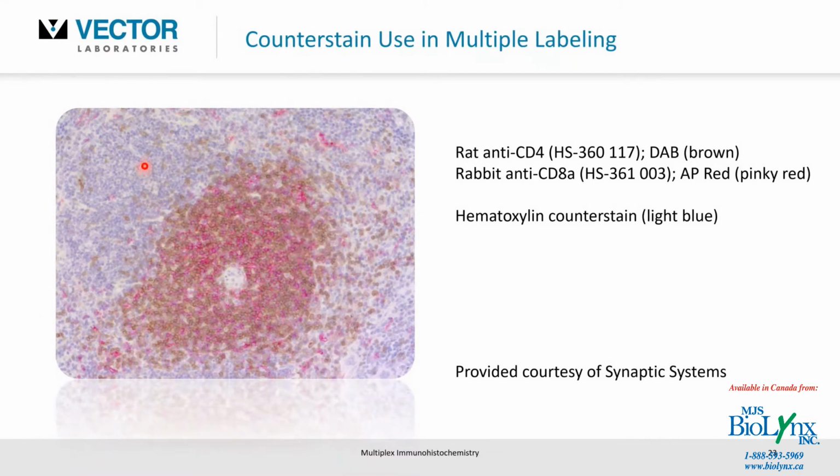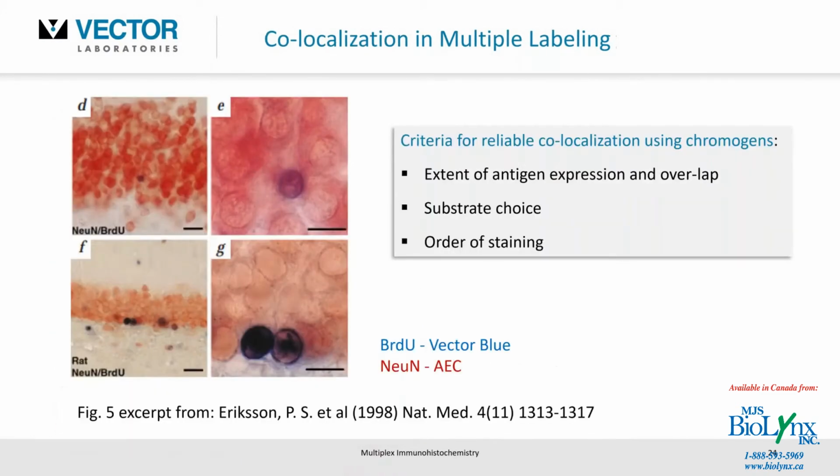And then the outer line, I should say, excuse me, the hematoxylin counterstain, again contrasting with these. You can see a lot of different cellular architecture out here. This is just a snapshot of the tissue, but you can certainly see other structures beyond this. This shows you how you can appropriately apply a counterstain in a multiple label application.